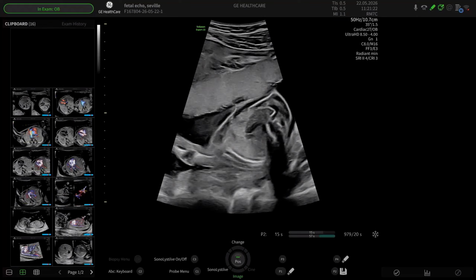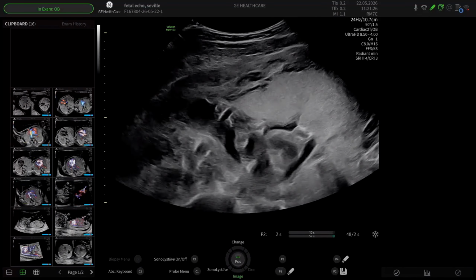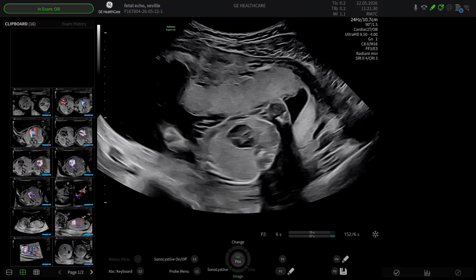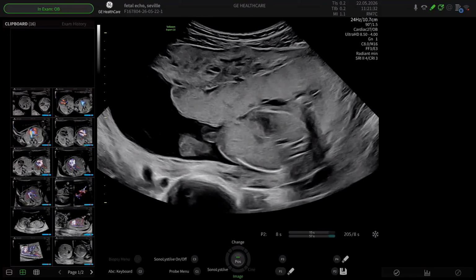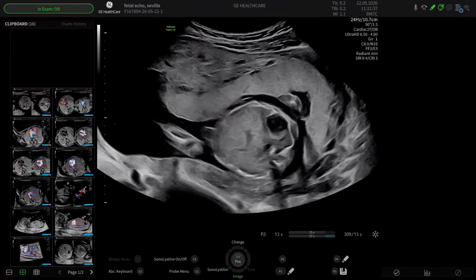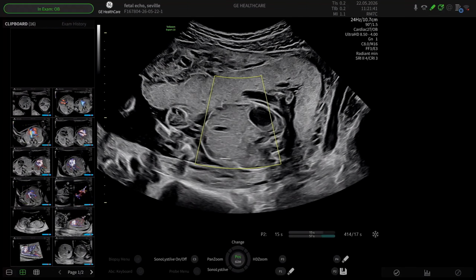So this baby is also in breech. I open my sector width as I do a sweep from left to right hand side. In doing that single sweep, I see there's a single live baby on board presenting in breech presentation. So I'm going to go through this reasonably quickly. I'm going to start off with the first ISUOG section.